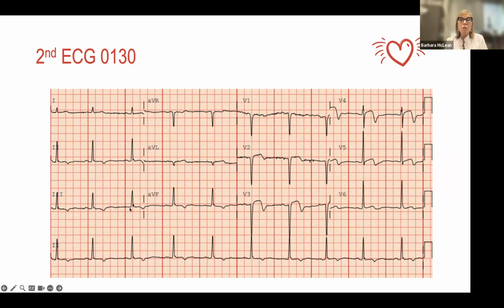We've got these little T wave inversions. We have what we would call a biphasic T wave, where it's above and then it goes below, and very significant. Have a little in V2, but it's very significant in V3, V4, and V5. So still, I'm the attending, I'm the bedside nurse, I'm the EKG technician, I'm looking at this, I'm saying, this is just not a very expressive EKG. I want it to express that the patient is having an acute process because this troponin expresses that, but I'm not seeing it in the EKG, okay?